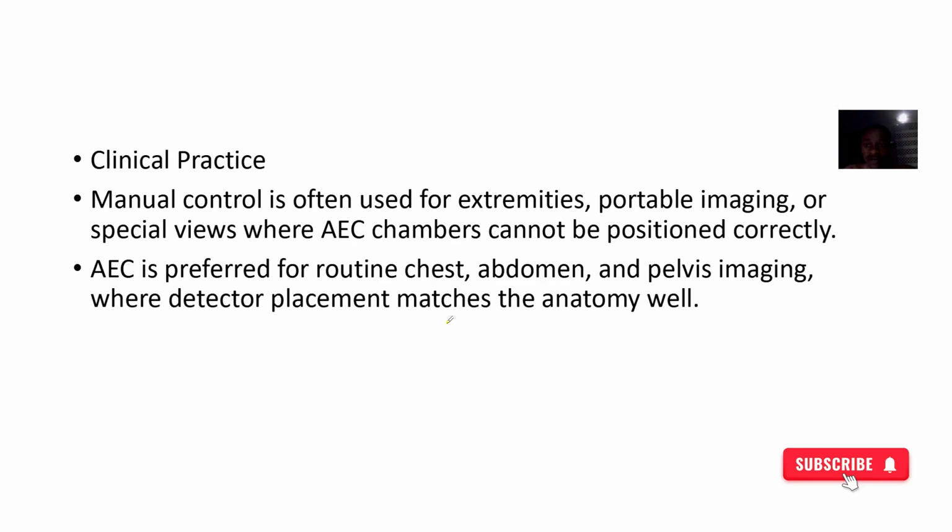So it's very important because it protects the patient from too much exposure.